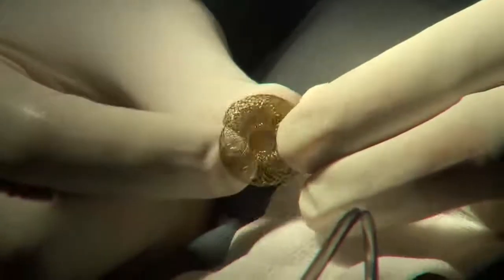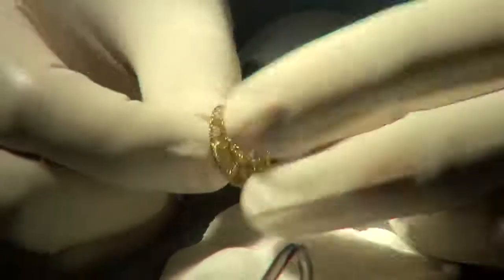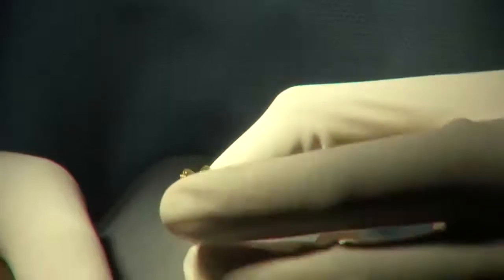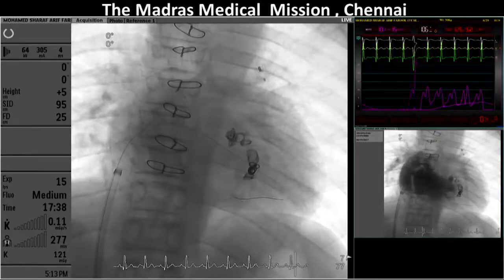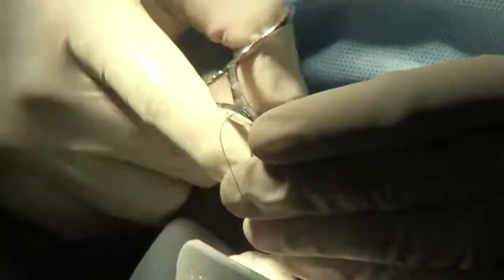And you have a high pressure gradient between the Fontan pathway and the left side, or the atrial side, of the heart. And this high pressure gradient, in combination with the anticoagulation, and this patient should of course be anticoagulated in this kind of situation. From what I think and what I've seen, I think this is absolutely fine. And if you start now to manipulate a device which is completely new, I think you do harm to the device, and I think this is not a good approach, sorry to say.